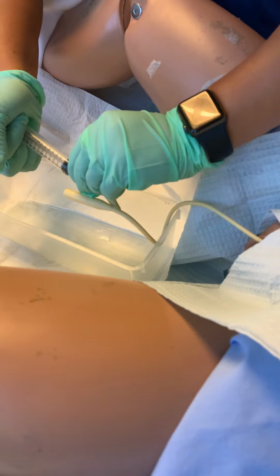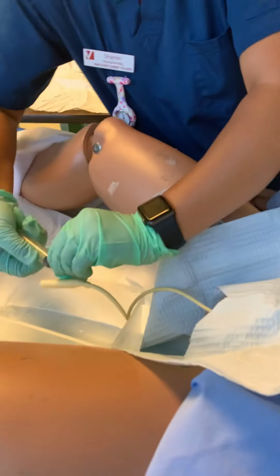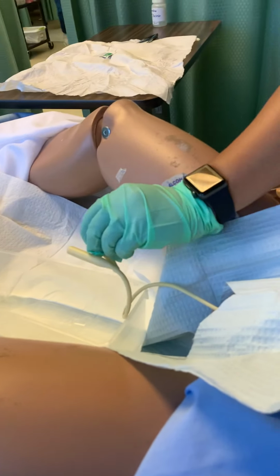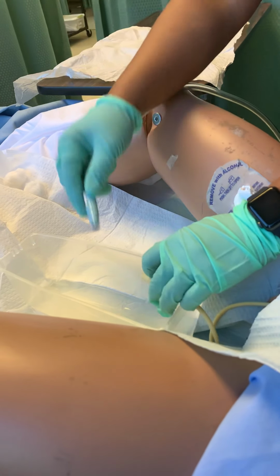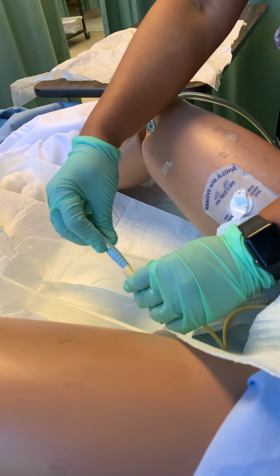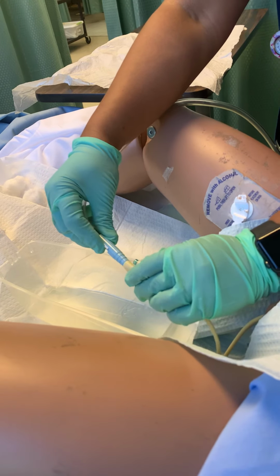Oh God. Did I inflate it? And then there's no water. Pressure. Sharps container. And then attach my drainage bag. No, you can't raise this up. Sorry. It's supposed to be 15, right? 30. 30, yeah. So this one you can attach that. That's sterile. This is very hard, I don't like this one.